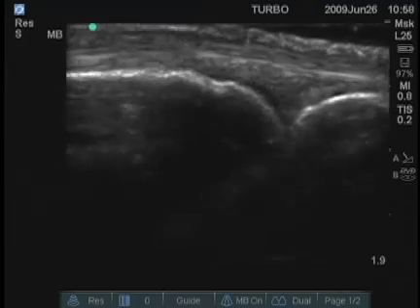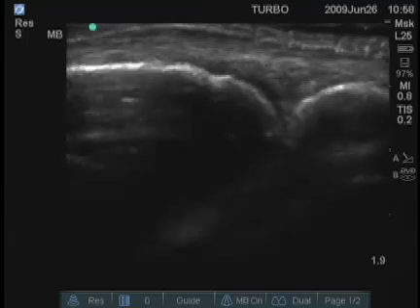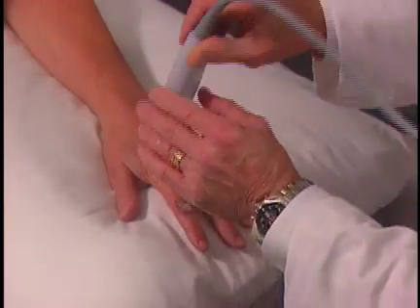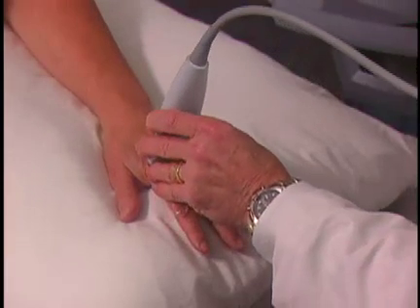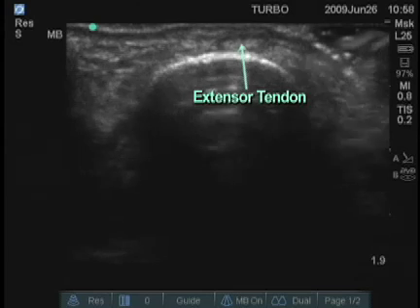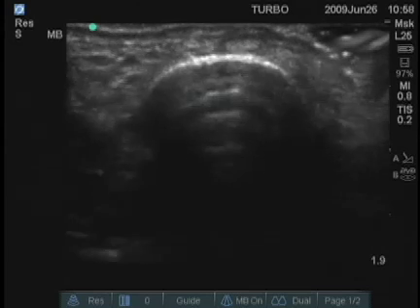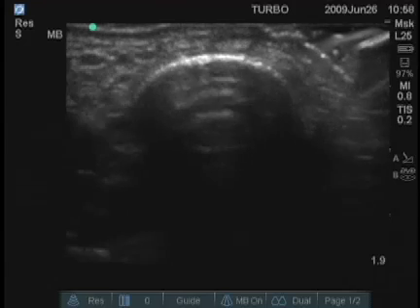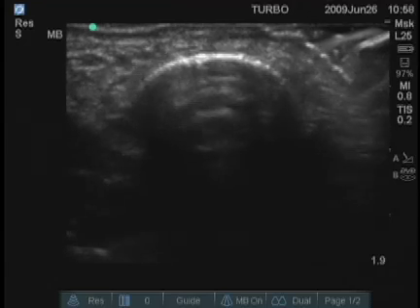Could you move your finger just up a little bit? You can see that tendon moving and the joint moving. We'll then take a transverse image and see a transverse oval image of that extensor tendon. We're going to look for hypoechoic or anechoic fluid or synovium around it. In this case, none of that is present.